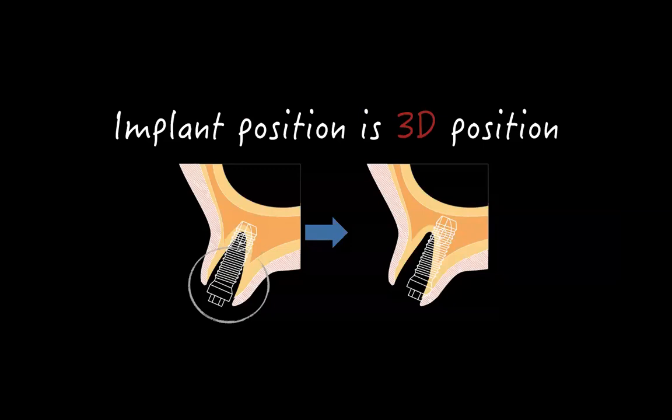And a lot of people tell me, I think the immediate implant placement, right now we're not talking about loading, we're talking about placing the implant in the correct location. So it was very easy. People say, I'll take out the tooth and I put an implant at the apical portion and I go just beyond the apex and I put the implant in there. That's the easiest way to go about doing that.